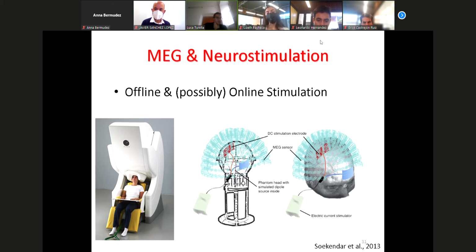A very advanced, recent and debated use of MEG. If you come to us and I show you the MEG lab, I will have some photos later on and you will see what it is. The first thing that the technician will tell you is you cannot take any mobile phone, any metal object inside the MEG because this will distort the signal.